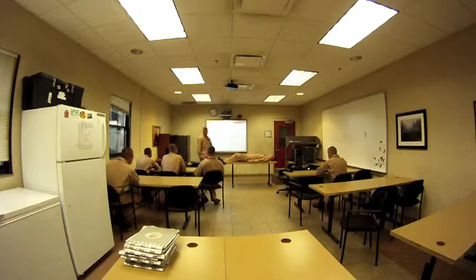All right, step one, you're going to apply your ankle hitch. This is your ankle hitch. Just make sure everything's nice and loose. You come in here and you tell them, I'm applying the ankle hitch for you. You don't want to lift the leg any more than you have to. Pull it in. Try and keep it above the ankle, not necessarily on it. Go ahead and tighten the green one. They're all color coordinated. We'll go over the colors here momentarily.